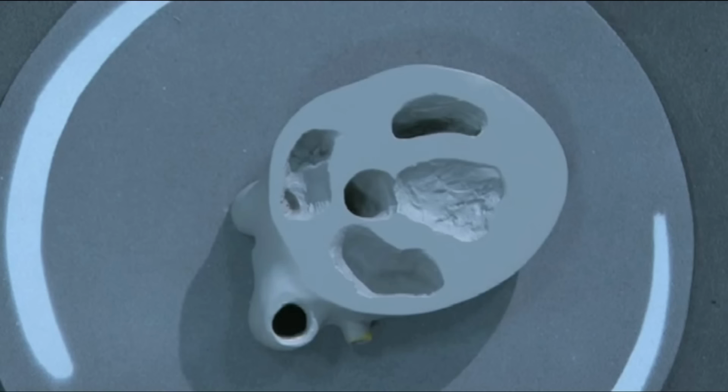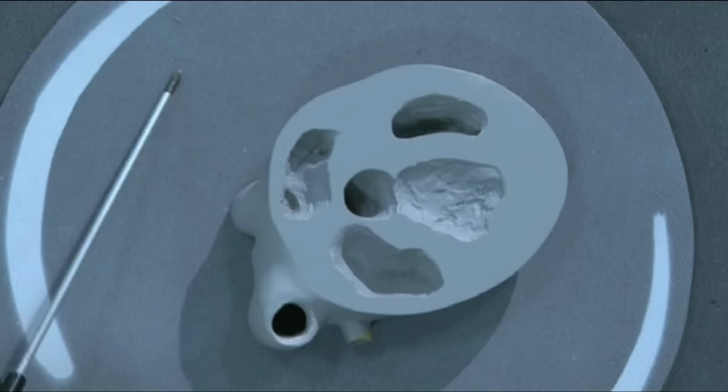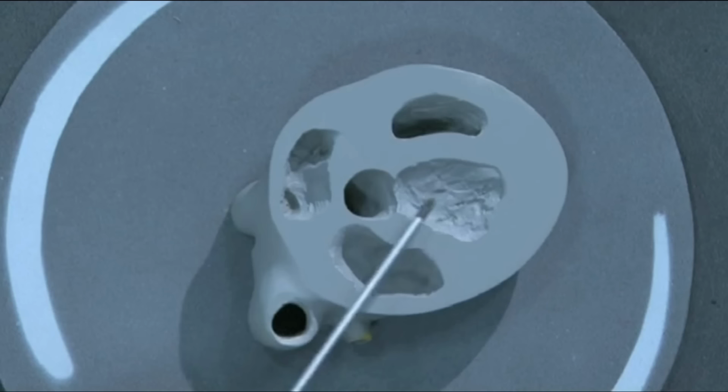So in this case, we can see that the spine is down on the bottom left of the screen, which means that the baby's head is into the screen. The left side of the baby is on the right side of the image. The right side of the baby is on the left side of the image, and the aorta in the centre here can be seen having turned the corner and starting to go up towards the head.